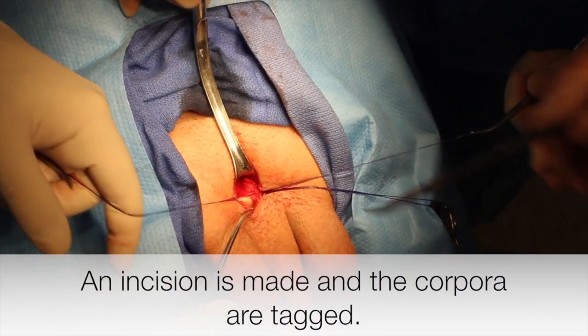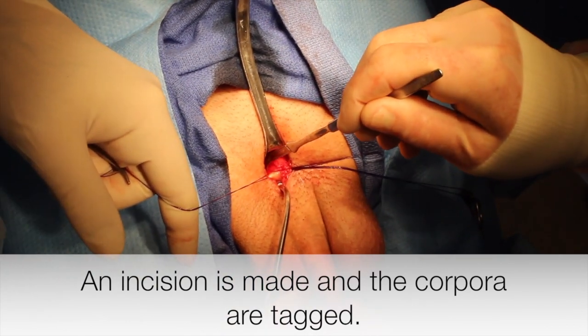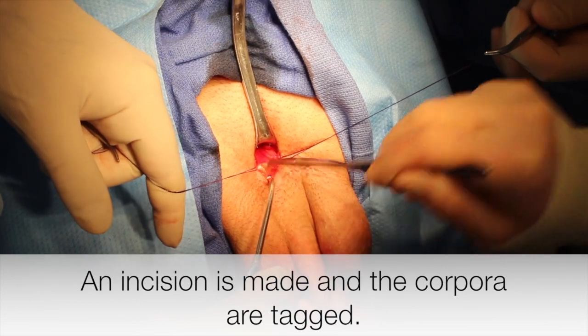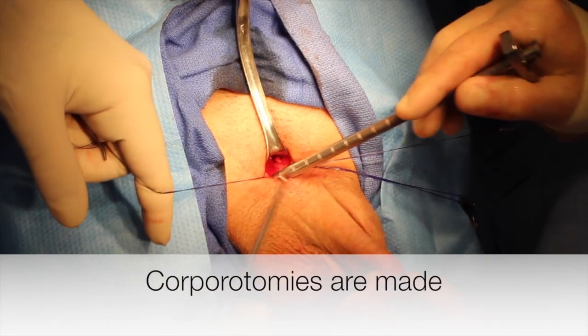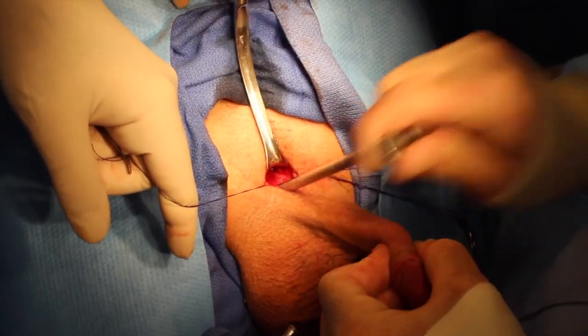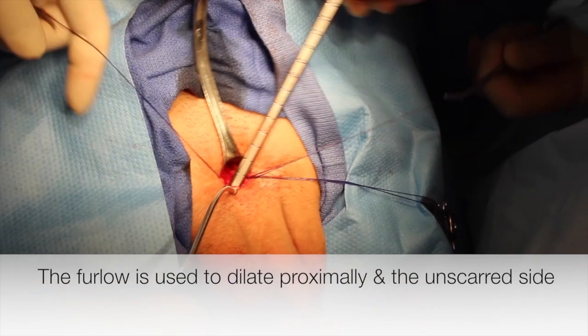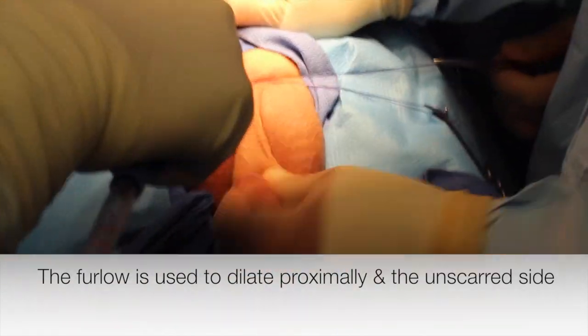A standard infrapubic approach is utilized and incisions are made into the corpora that are tagged. Once the corporotomies are made, the furlough is used to measure the corpora proximally and distally on the unaffected side.